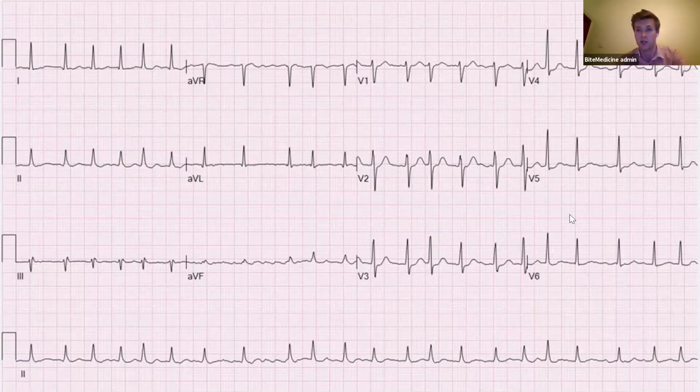So here's the ECG. Again, thinking about what Shoaib went through last time, rate, rhythm, important things to look at. Okay, so hopefully you've had long enough to look.